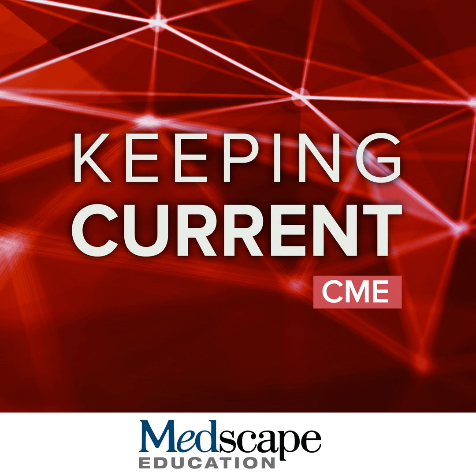So next, we'll discuss the imaging protocols, which can be directly linked to those separate MRI orders. In all cases, we need 3 key sequences that are performed consistently across all serial exams of the patient. These are T2 FLAIR for ARIA-E detection, gradient echo or susceptibility-weighted imaging for ARIA-H detection, and diffusion-weighted imaging to differentiate ARIA-E from acute ischemia. In clinical trials, the FLAIR has traditionally been performed using a 2D technique, but either a 2D or 3D exam is acceptable, whichever can be performed consistently with high quality in your practice.